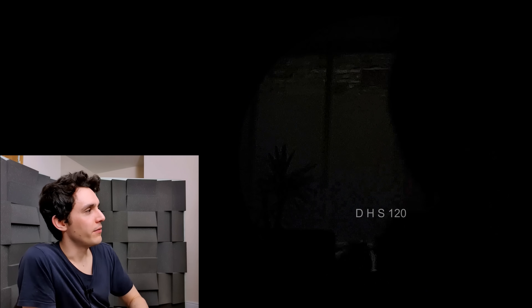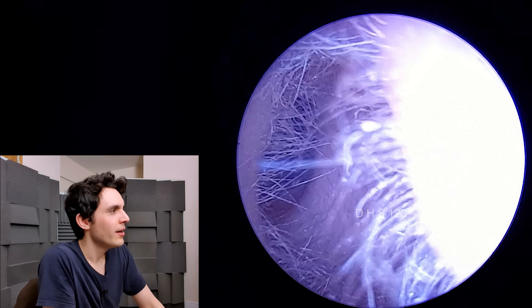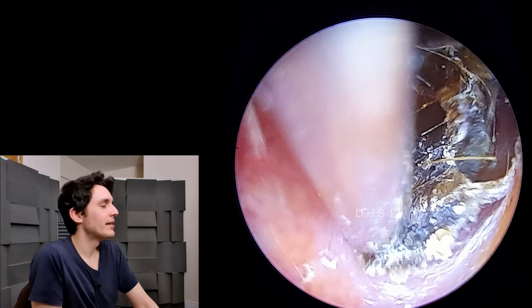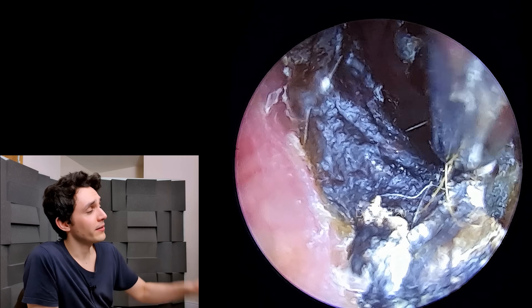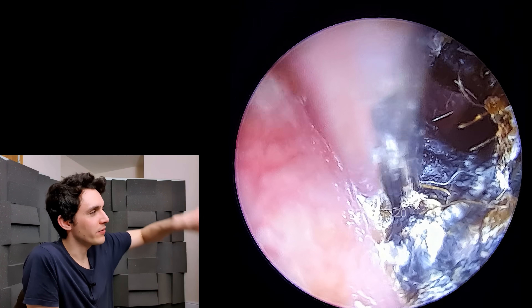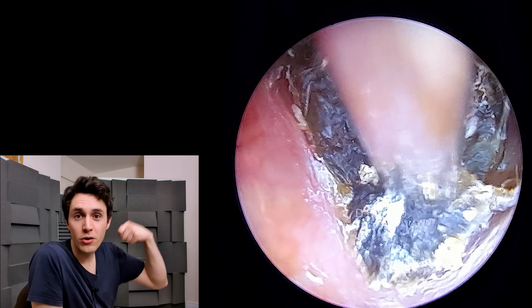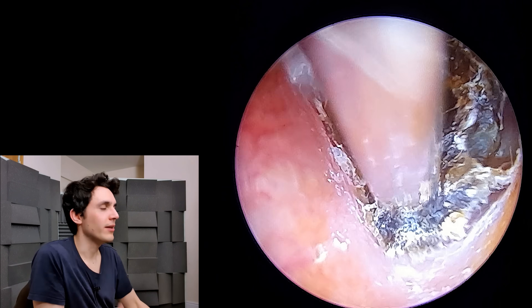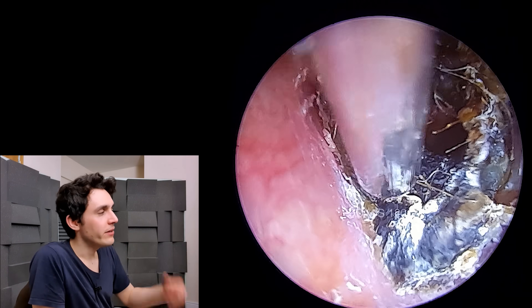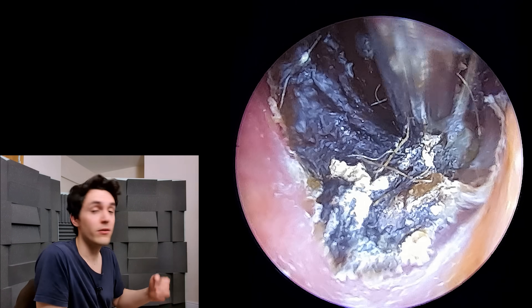I'm fairly confident there is no horrendous complication there. As for the source of the blood — I'm not entirely sure. This wax is pretty deep and the crusty formation around the ear canal is suspicious, so it may be that he shoved a fingernail in or used a cotton bud and grazed or lacerated the skin of the ear canal — that's probably where the blood came from. Even if you see just a little bit of blood from somewhere it's not supposed to bleed, of course you panic.